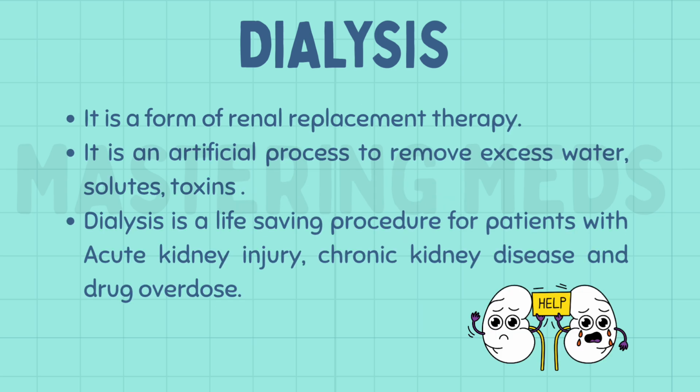Dialysis is a form of renal replacement therapy. It is an artificial process to remove excess water, solutes, and toxins. Dialysis is a life-saving procedure for patients with acute kidney injury, chronic kidney disease and drug overdose.